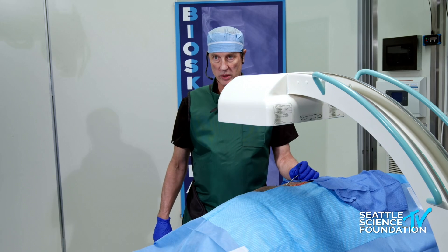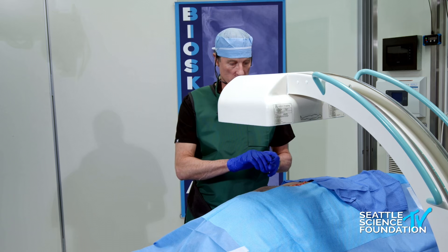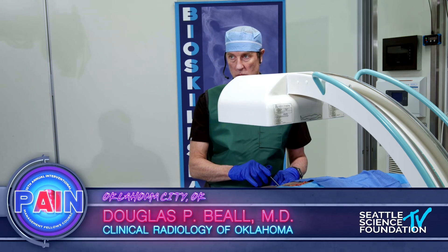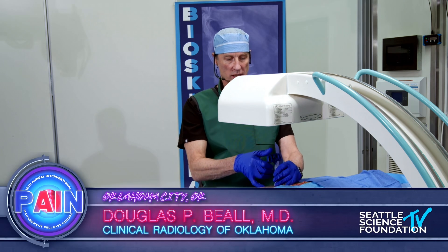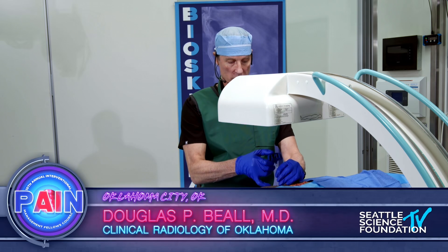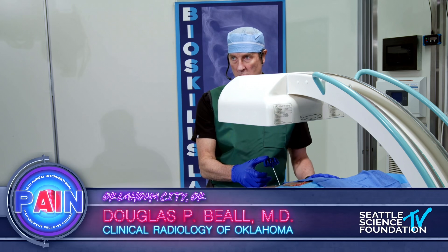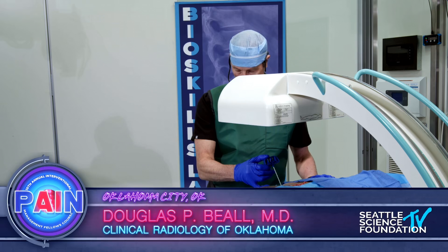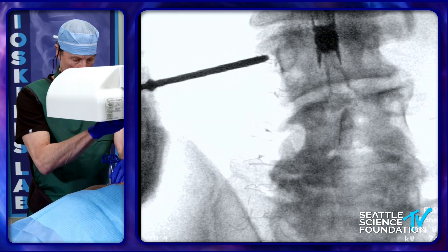Ready in the lab. We'll have assistance from Ramsey from Merit who's going to help us demonstrate the Arcadia balloon and the power curve. So it's going to be a typical transpedicular access. I make it a little flat here, rather than the typical 10 o'clock and 2 o'clock position, and I'm going to come over and start really about the nine o'clock position on the vertebral body.